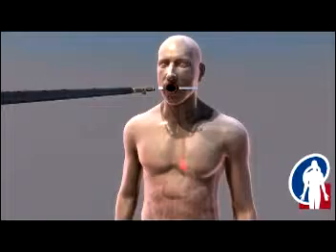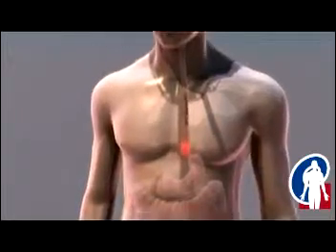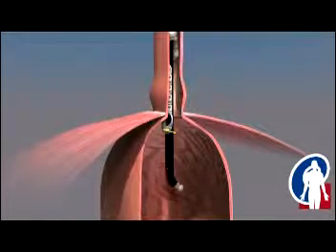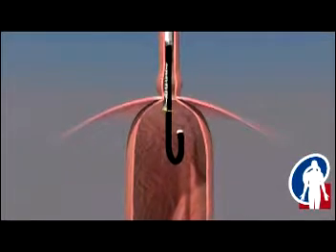TIF is performed under constant visualization by the surgeon. While the patient is under general anesthesia, the Esophyx device, riding over the endoscope, is gently glided down through the patient's mouth into the stomach. The stomach is inflated, and the endoscope is advanced and turned so that it is looking up at the entrance to the stomach. This is where the anti-reflux valve will be created.